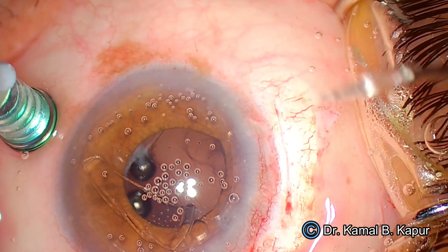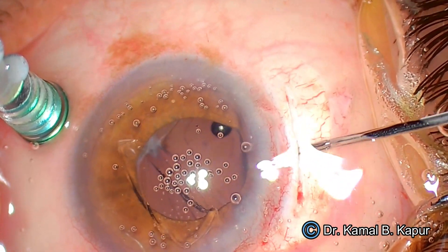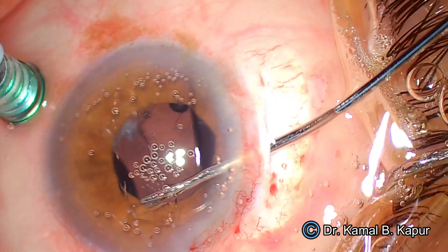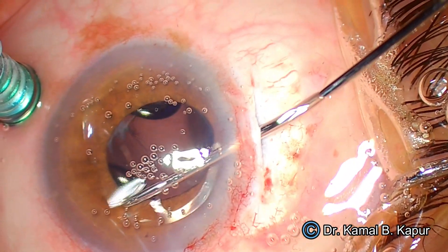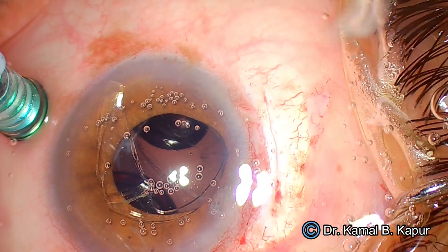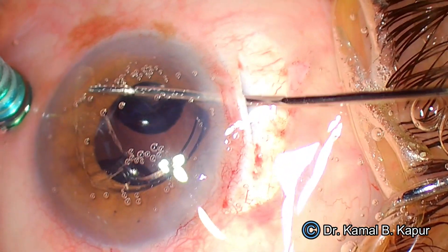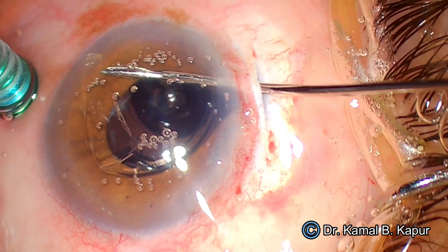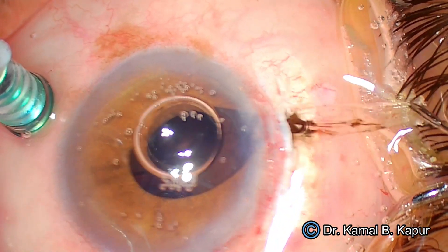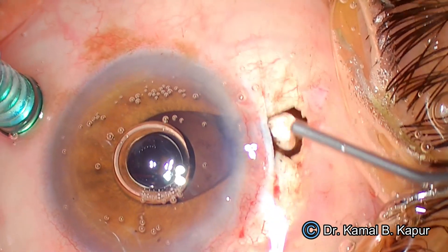The eye is slightly hypotonic; I've again switched on the fluid. Just before pulling the IOL piece out, I realize that pulling from the haptic side might damage the endothelium and the IOL may get stuck. So I decide to rotate the lens and hold it from the narrower part. This forceps does an amazing job of gripping the IOL very securely. The moment the IOL piece is out of the eye, we switch off the fluid again.